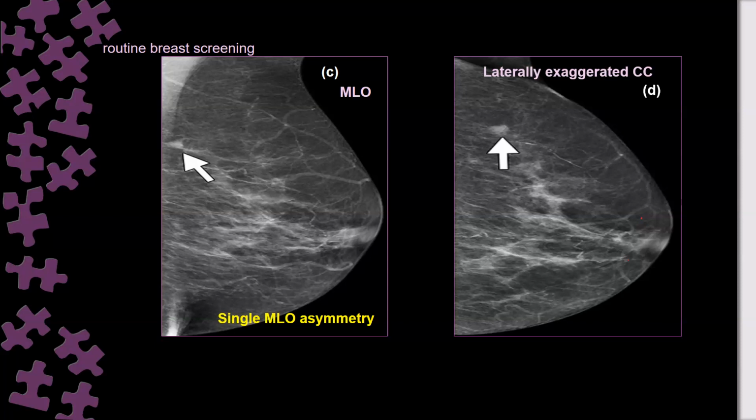No, it depends. In the previous one you were in doubt, is it real or not? But here mostly it will be real. But at the end you can do a spot and in the same setting go for the extended lateral, or you can do the extended lateral, and if you did not see it, it can still be technical. But yes, you have to do the spot first and then go for the extended lateral view.